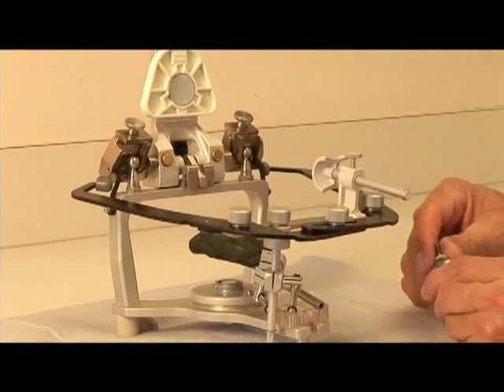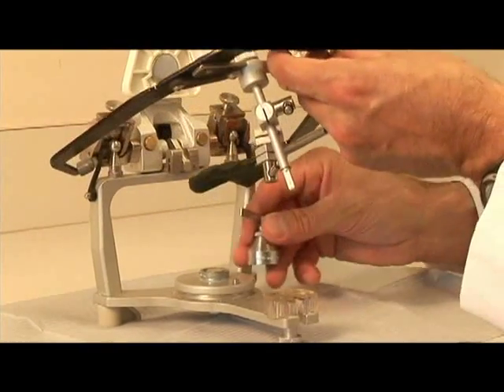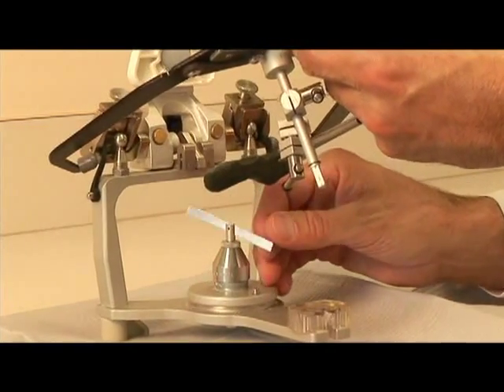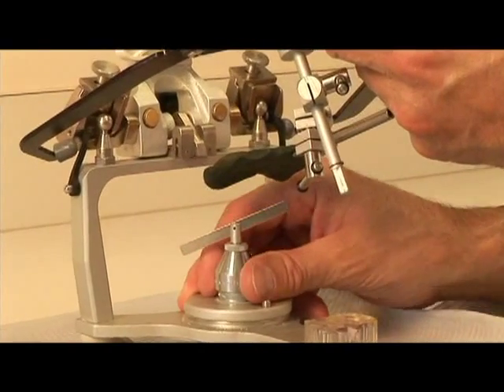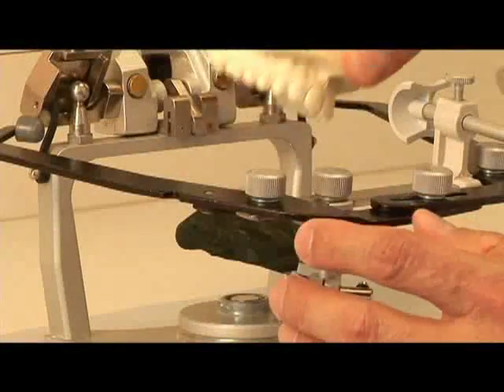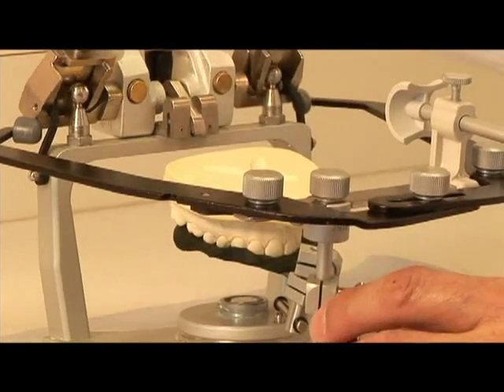Many clinicians prefer to use a face bow fork support when mounting the maxillary cast to support the face bow fork during the mounting procedure. This is an optional piece, and as is demonstrated here, it is secured by means of the magnet. Next, the maxillary cast is positioned and is now ready for mounting.